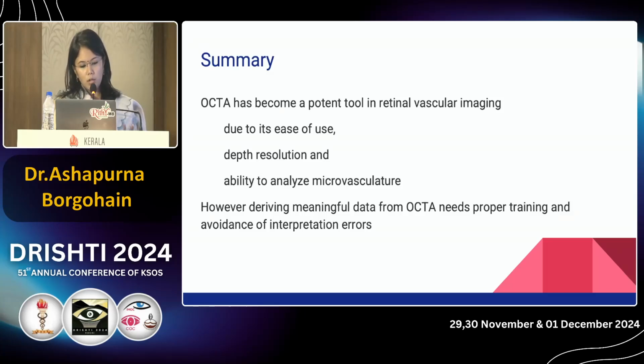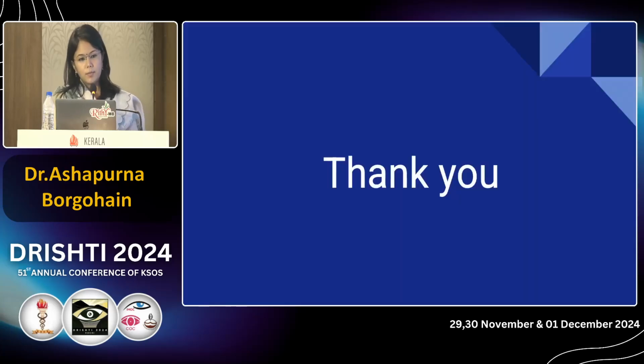However, we should be aware of the different artifacts, and we will get meaningful data from OCTA only if we know about the artifacts and have some proper training. Thank you.